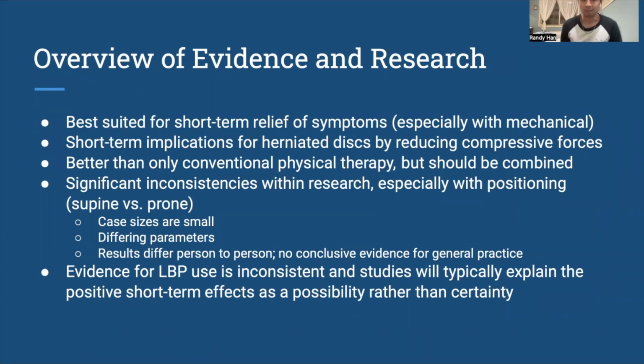So when we're talking about traction, both cervical and lumbar, and thinking about evidence-based practice, there isn't a lot of research or evidence to suggest that we should be doing this, especially if we're thinking about long-term issues.